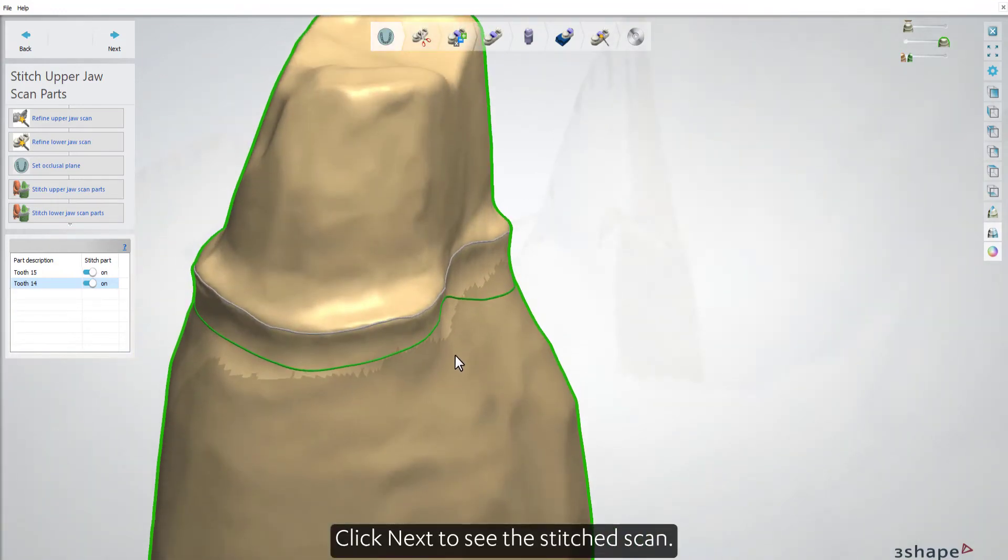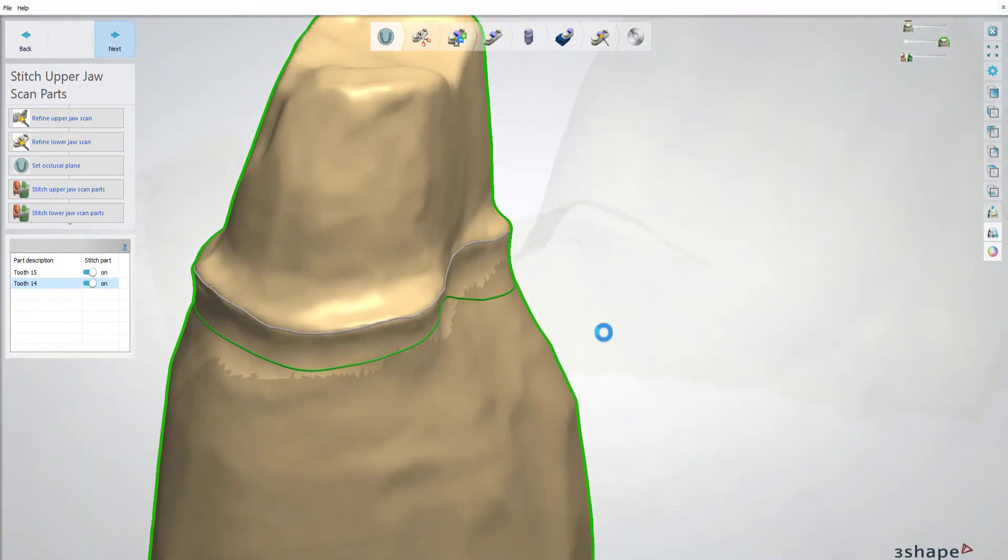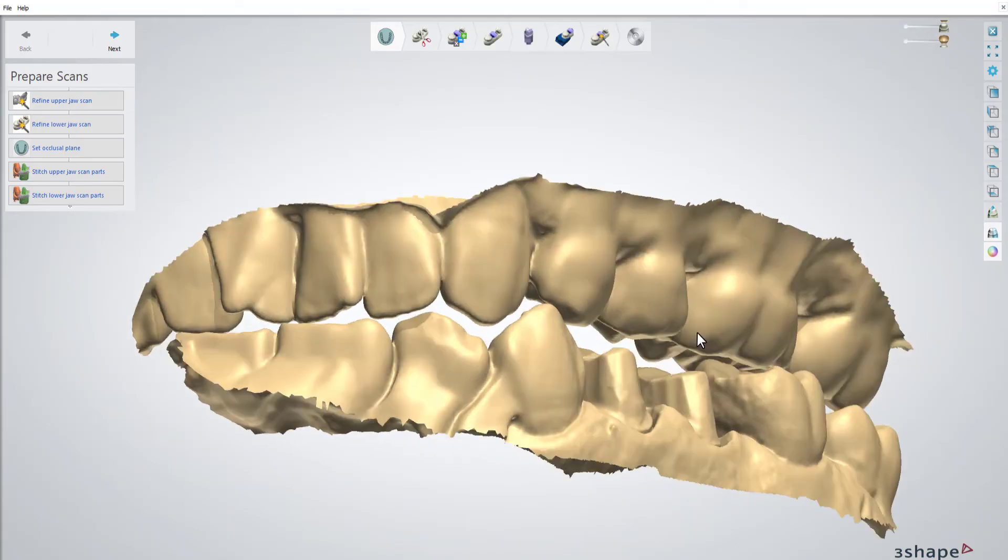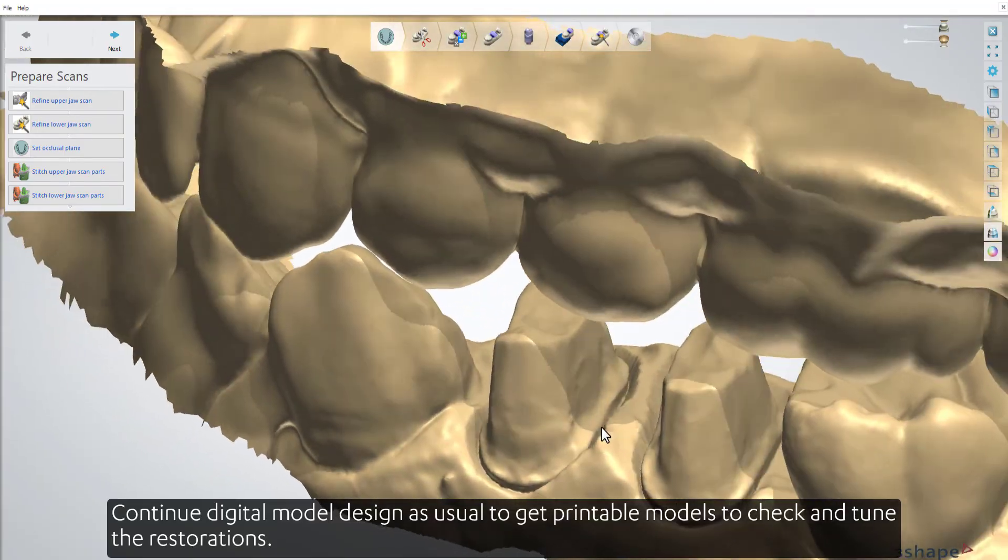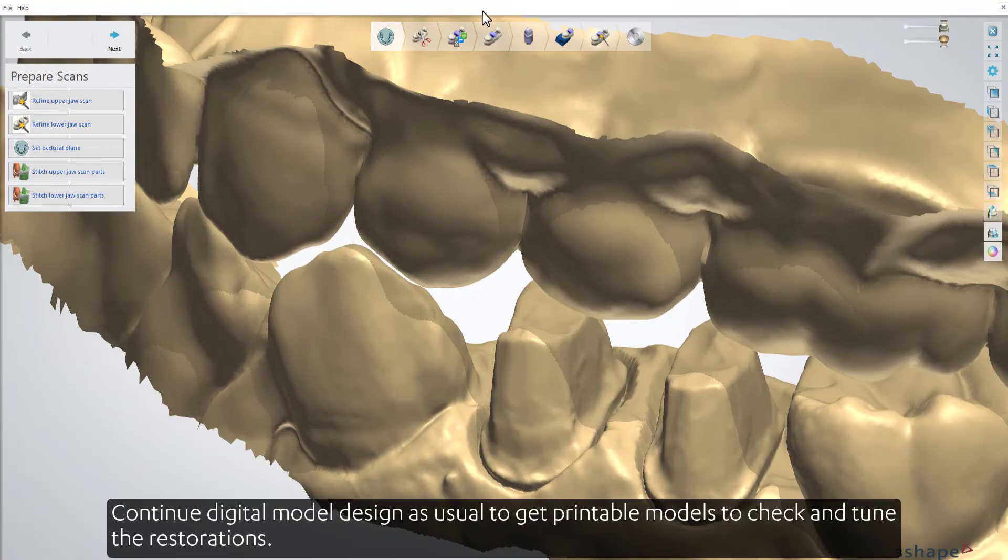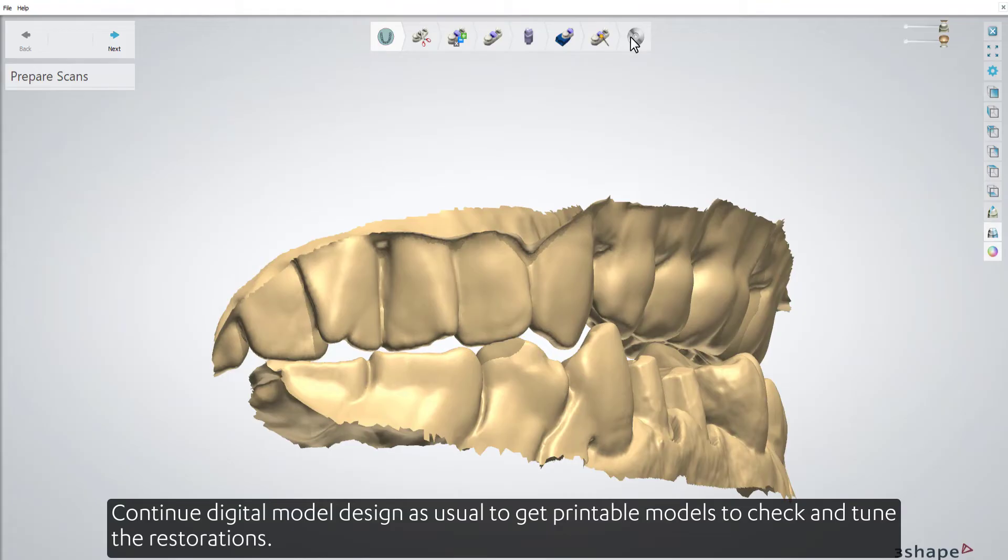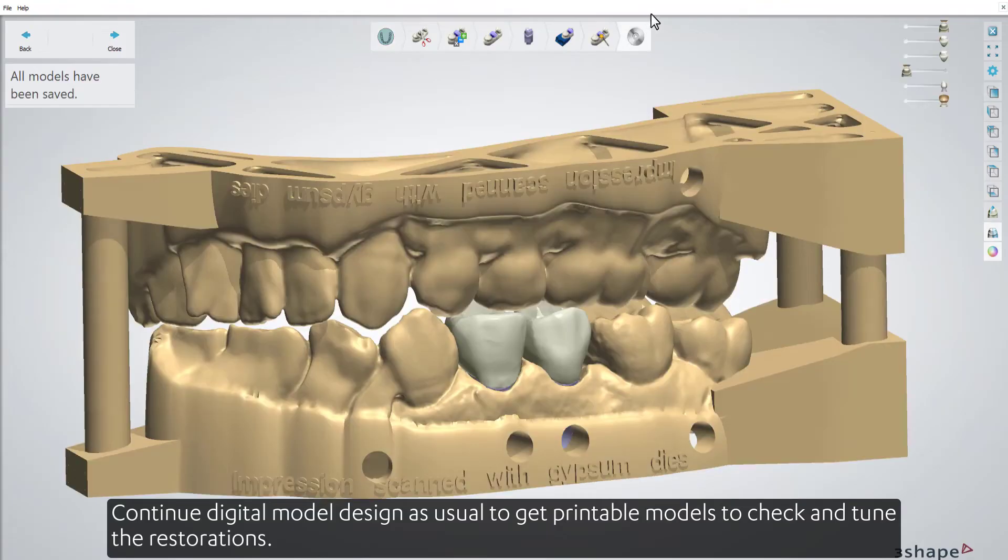Click Next to see the stitched scan. Continue digital model design as usual to get printable models to check and tune the restorations.